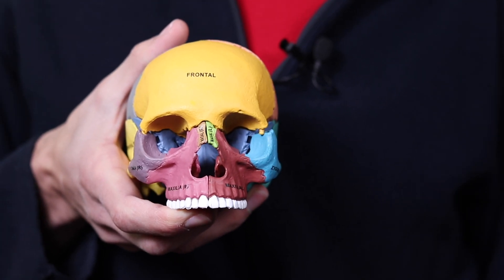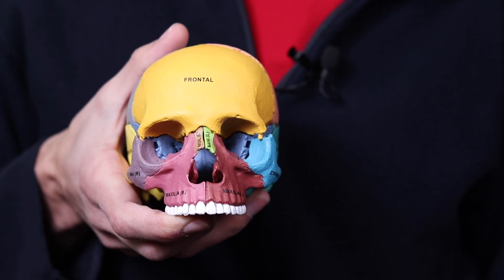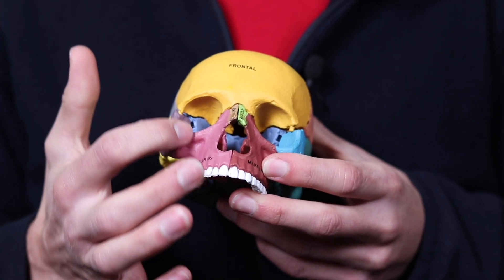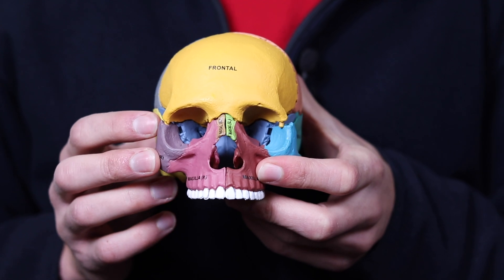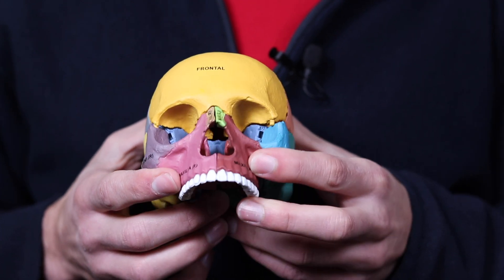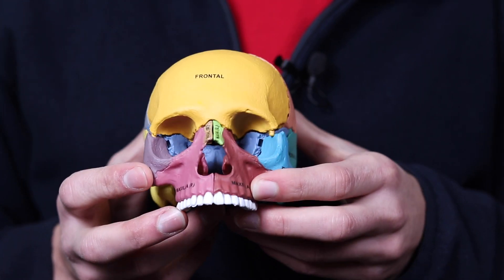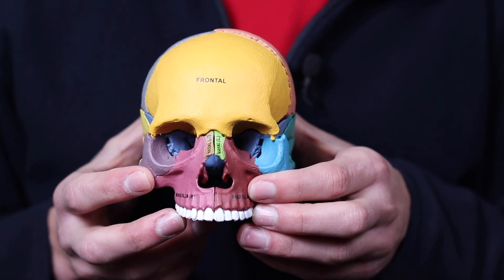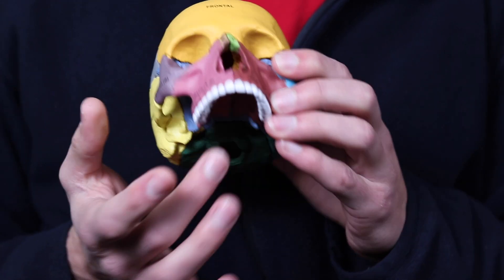I want to take a moment to talk about the DOME procedure. DOME is a surgical procedure that often accompanies MSE where the mid-palatal suture and the sutures that connect the maxilla to the zygoma, the cheekbone, are cut in order to guarantee a successful split of the mid-palatal suture. Probably the biggest risk with MSE is that you install it, go through all that trouble, and then the suture doesn't actually split because it overpowers the appliance and the appliance fails before the suture is able to successfully split.